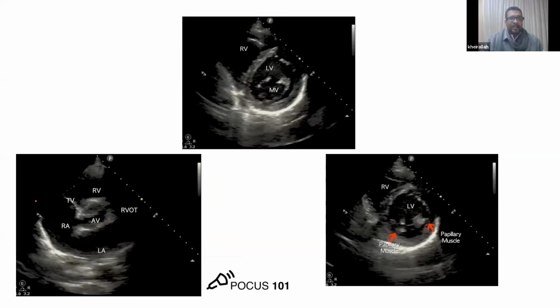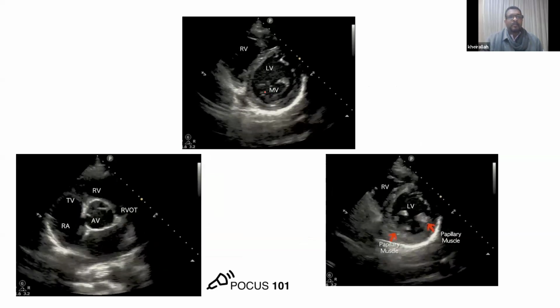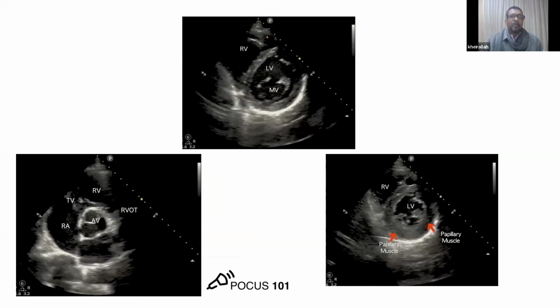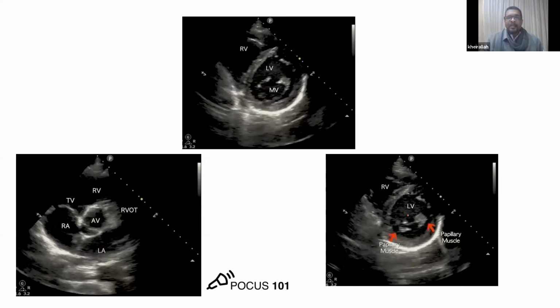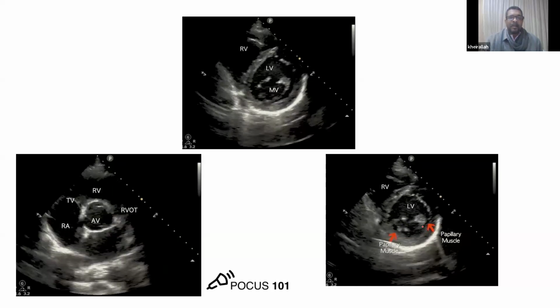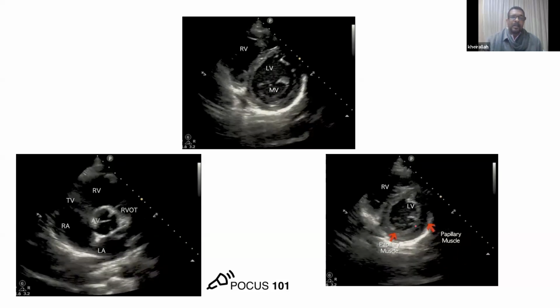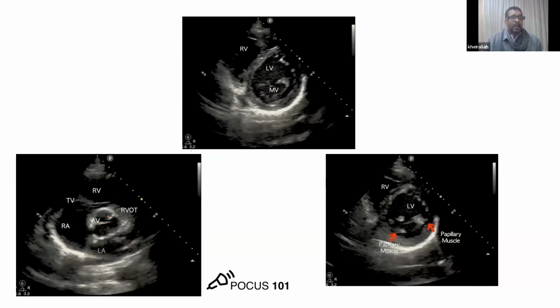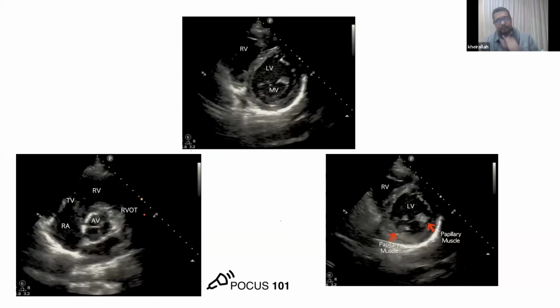And here in the short axis, you see this one at basal level because I'm seeing the mitral valve, and I will see also part of the RV here. Here at mid-cavitary level or papillary muscle level, you see the anterolateral and posteromedial papillary muscles. And this is at the very basal level in which you see the aorta in the middle, the RVOT on the right, tricuspid on the left.